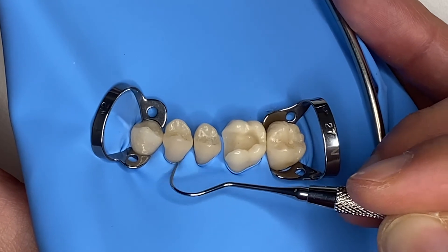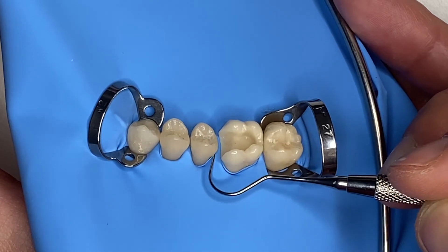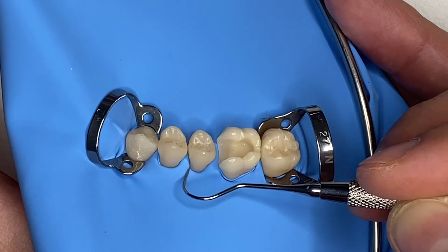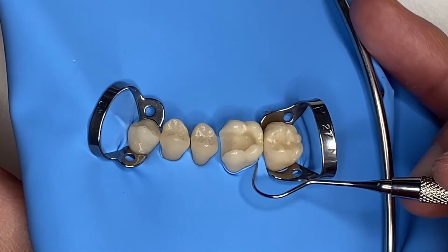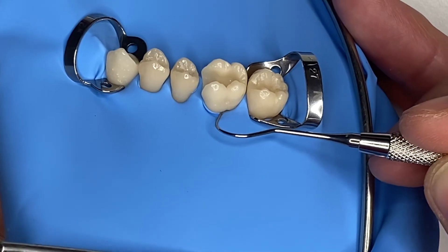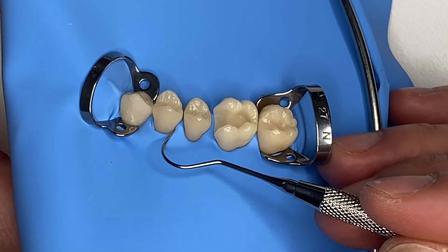You can already see how the dam inverts by itself almost. I go to tooth 1.5 and I do the same. You see, I don't punch through the rubber dam, I don't touch it — I just follow the contour of the tooth using my probe at a 45-degree angle, and the dam inverts by itself almost.